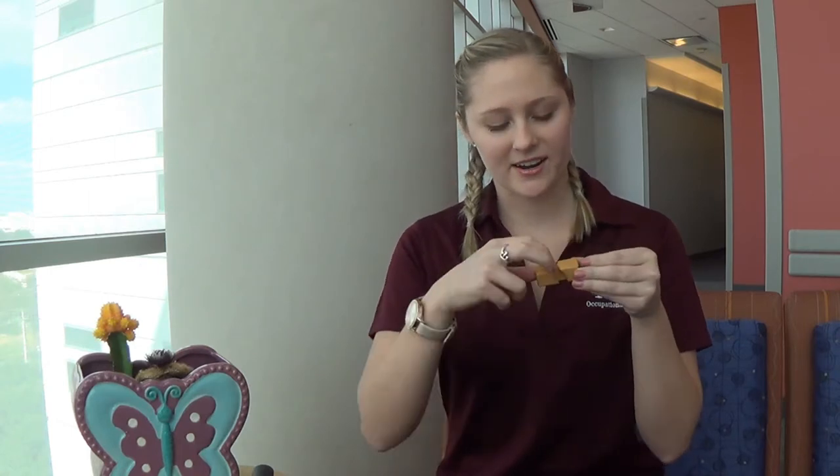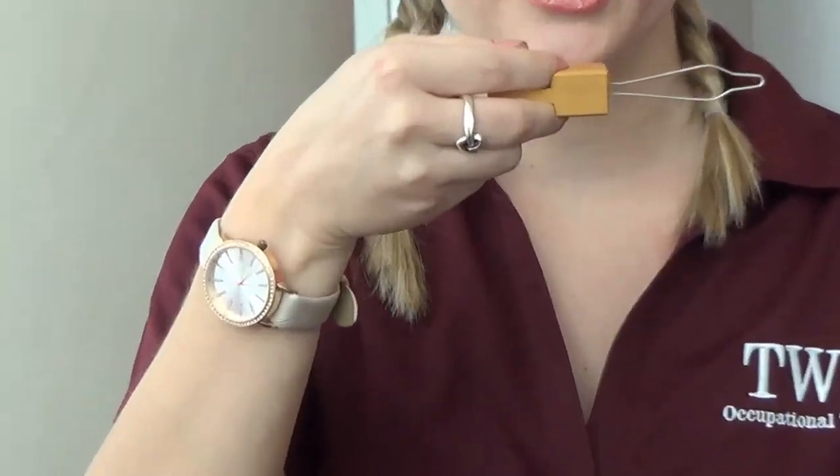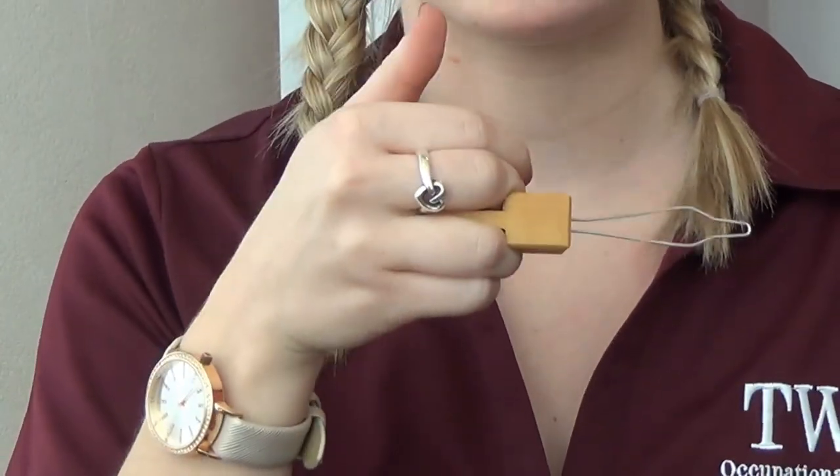Another type of button hook also has a round top, and you can grasp it with your fingers. Or if you're having trouble with any specific finger, you can grasp it with three fingers, two fingers — however is best for you. The last type has spaces where you can fit your fingers, and you can use it with your two strongest fingers, whichever fingers work best for you.